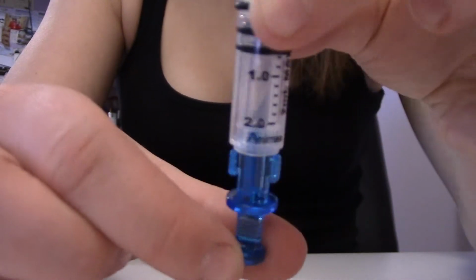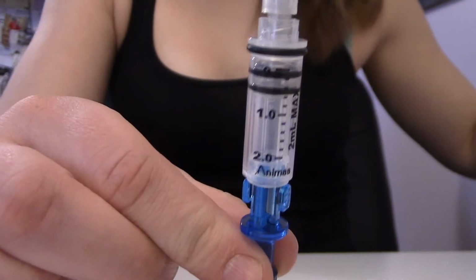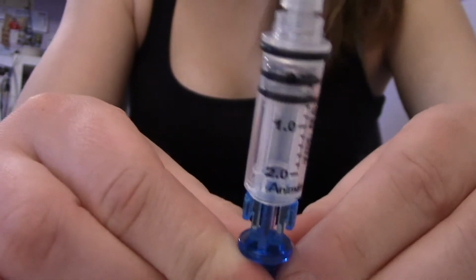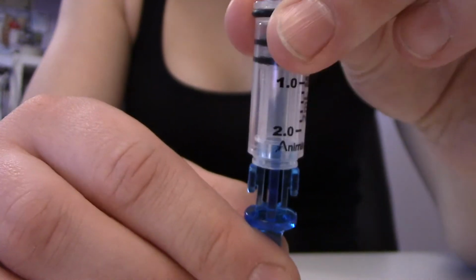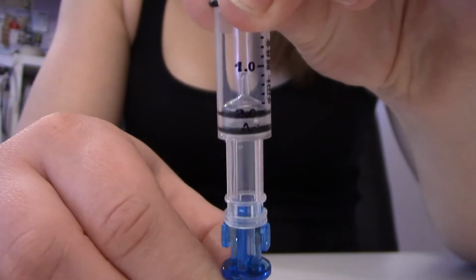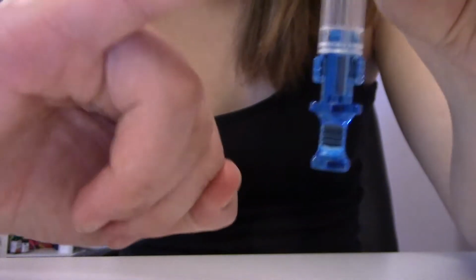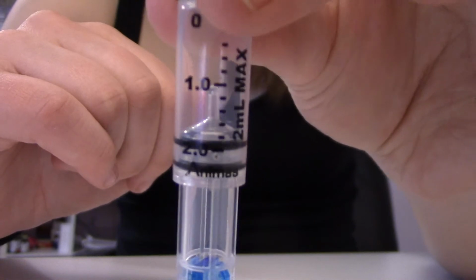Perfect. Okay, so next thing you're going to do is you're going to draw the amount of air you want to put into your insulin cartridge, and then you're going to be pushing that into it. So for me, I just like to take as many units as I possibly can, because sometimes I'm bad and I don't change it for like 4 days. Cool. So I'm going to bring mine down to the 2.0 line and I'm going to match up the bottom there. It's kind of hard to tell, but do what works for you.